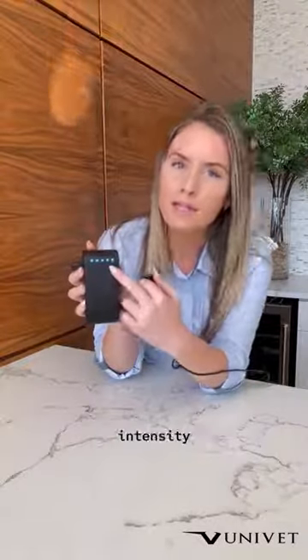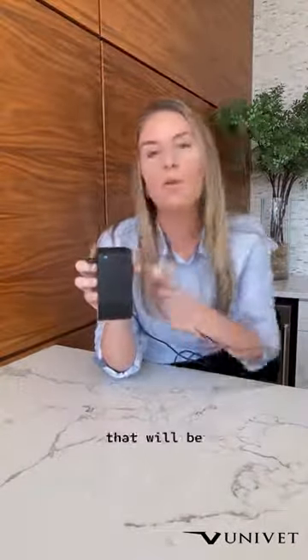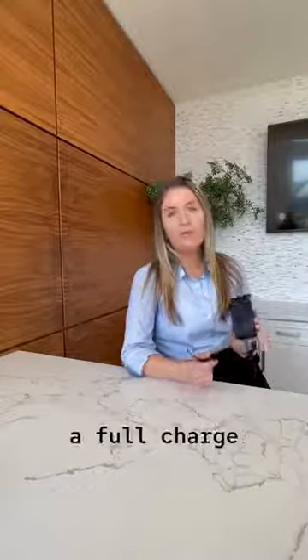If you go all the way up to the highest intensity, that will give you about nine hours of battery life. And if you go down to the lowest intensity, that will be about 20 hours. If your battery is fully depleted, it will take between four to five hours for a full charge.